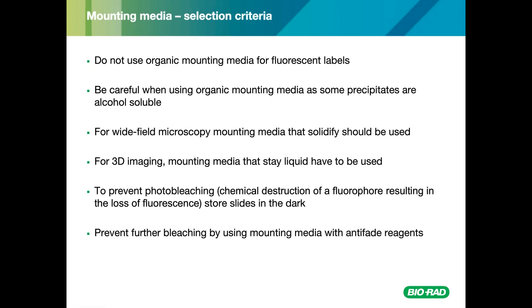For 3D imaging, mounting media that stay liquid have to be used. When using mounting media that remain liquid, the cover slip edges must be sealed with nail polish to prevent the medium from leaking. To prevent photobleaching, a process in which the chemical destruction of a fluorophore results in the loss of fluorescence, slides should be stored in the dark. Further bleaching can be prevented by using mounting media containing antifade reagents. However, as not every fluorophore is compatible with every antifade reagent, we recommend checking the manufacturer's datasheet prior to use.